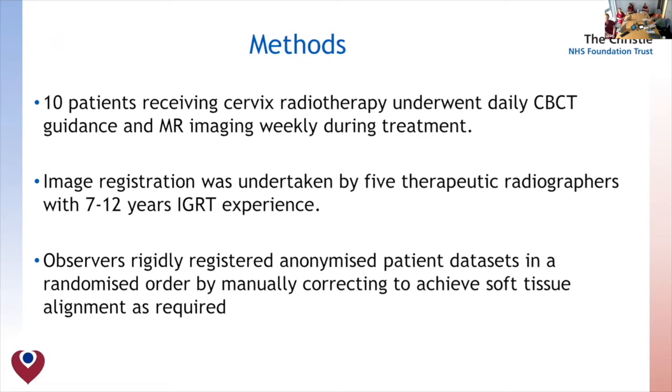So how we went about it, well, we were fortunate enough to have on treatment and MR images from 10 patients in a previous study. 5 therapy radiographers with some experience at least of MR and Monaco participated. They matched cone beam and MRs taken on the same day with reference CT planning scans, and also matched MR to MR using the earliest MR that we had as the reference image.